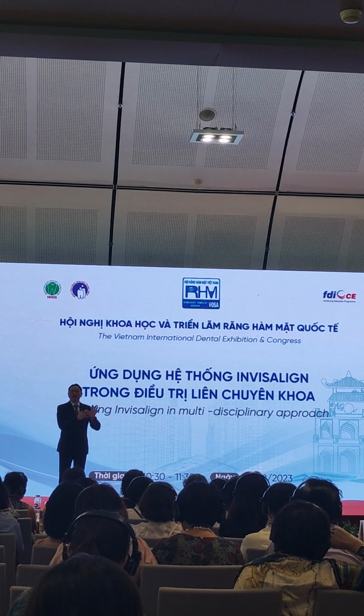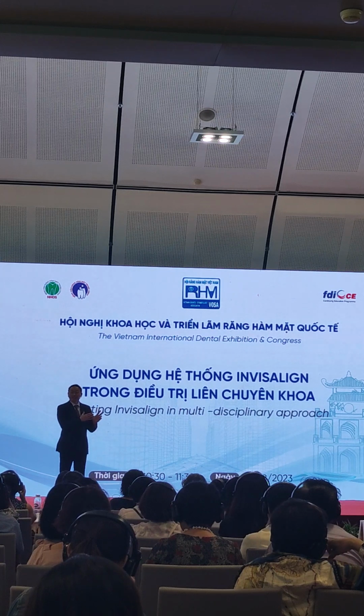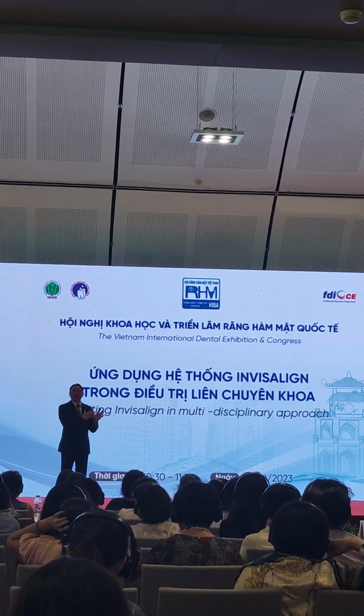for Invisalign to control anchorage, no matter whether we talk about extraction treatment or non-extraction treatment, we have several ways. Number one, we can do staging. It's a very important method because we can move teeth one by one. It's regarding how long the treatment will be, but we can do it in stages.